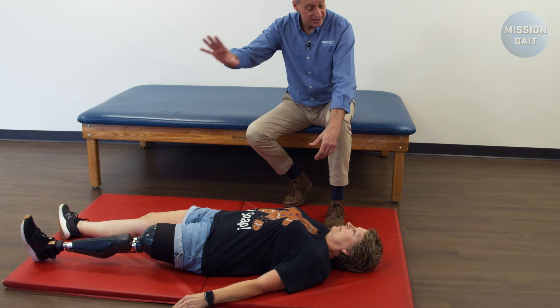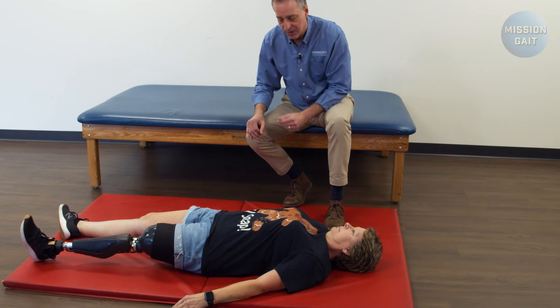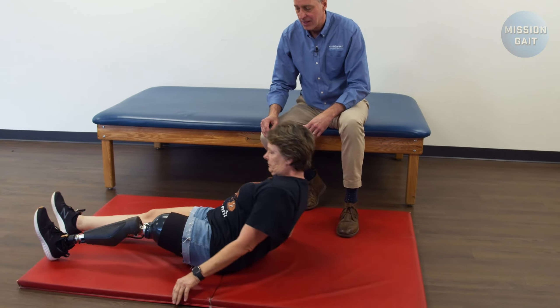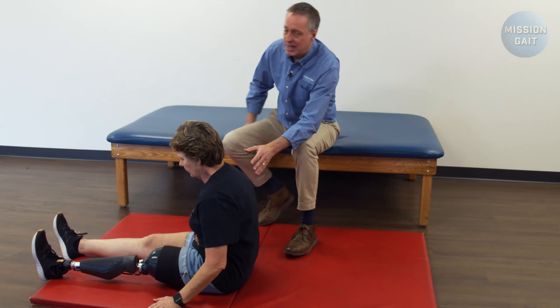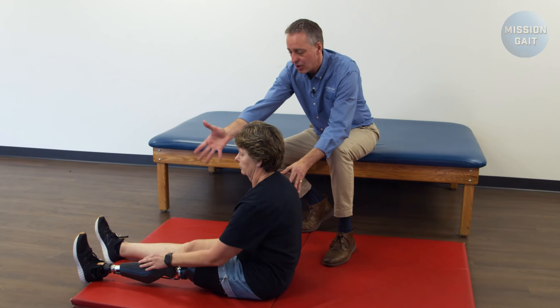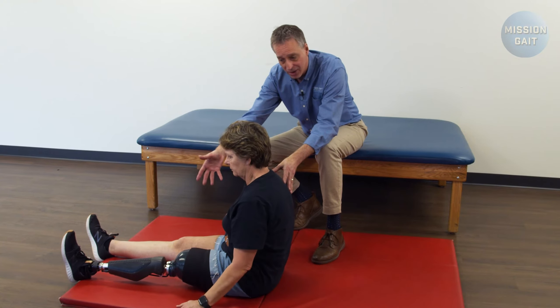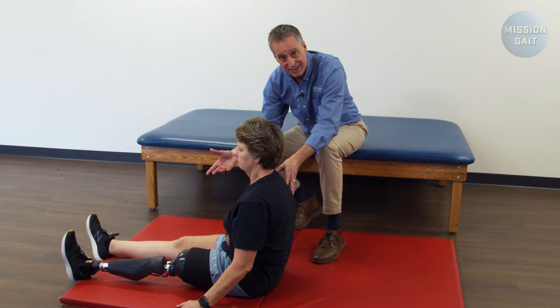If there's people around you, let them know that you've got this — don't yank on me, don't pull on me. The first thing you do is sit up, don't stand up. Go ahead and sit up and look at your prosthetic leg and make sure the prosthetic foot is facing the ceiling. If it is, then you know it's still donned correctly, nothing broke or shifted. If it is completely not on you, you need to re-don it before you stand up.